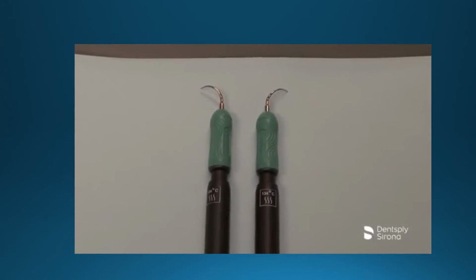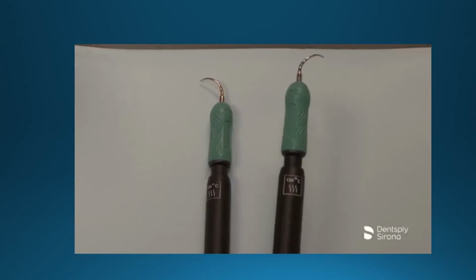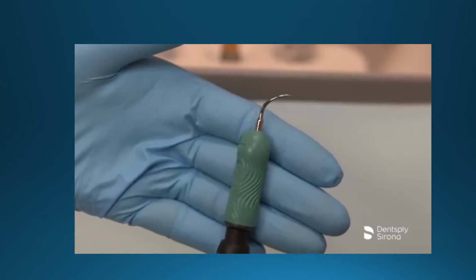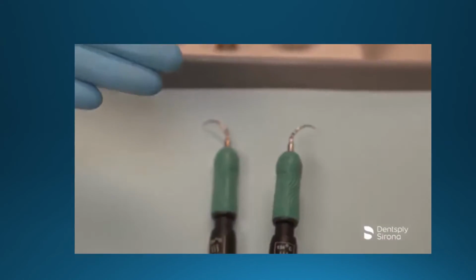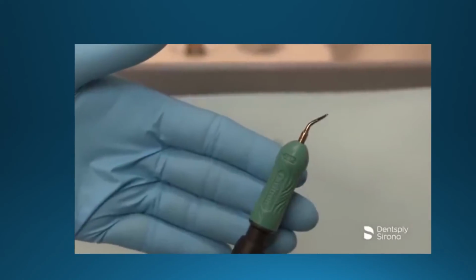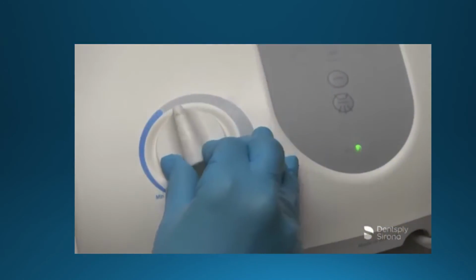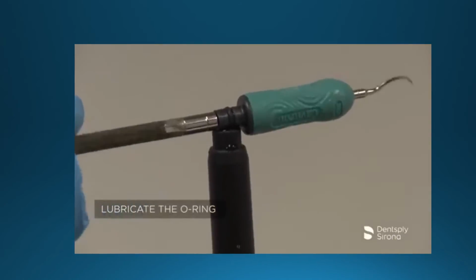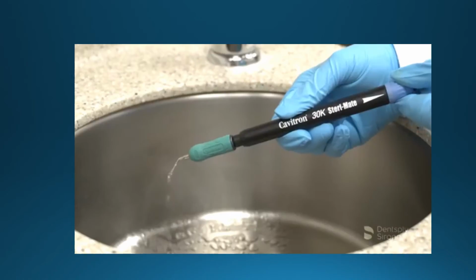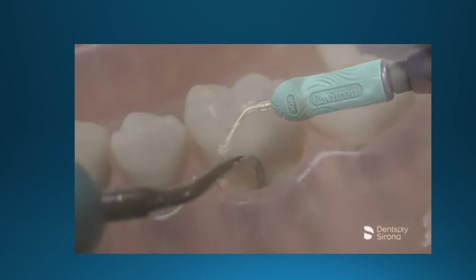This is the Cavitron FSI Slimline right and left curve. They are used for fine periodontal debridement in deep pockets greater than 4 millimeters. Utilizing these inserts provides maximum access and adaptability to root anatomy, including concavities and furcations. These inserts should be used at low to medium power levels. After the clinician has filled the handpiece with water, seated the insert, selected the power, and adjusted the spray properly, instrumentation begins according to the treatment plan prescribed for the patient.